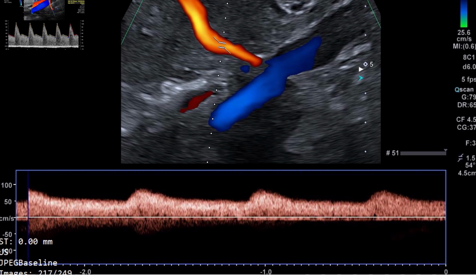So you see, now what we have here. This is the peak. This is the peak systolic velocity. This is our baseline. That's our baseline there. This is the peak systolic velocity there. So the peak systolic velocity is here from the base to there. So that's the velocity there. So this is the systolic velocity, peak systolic velocity.